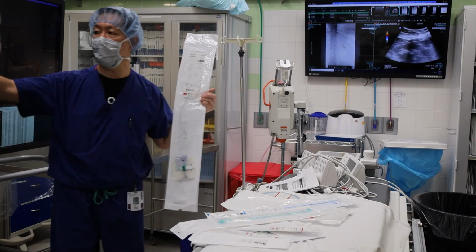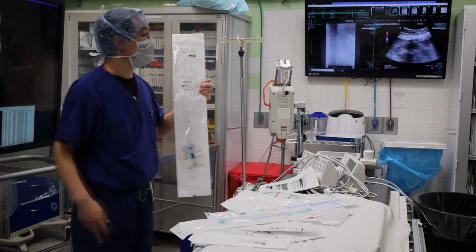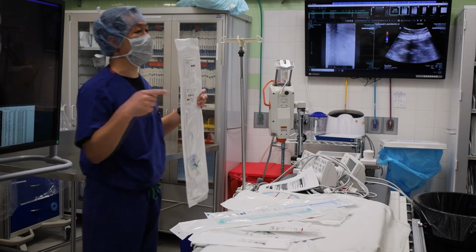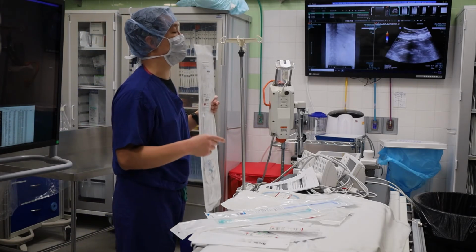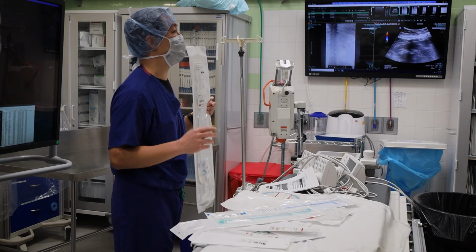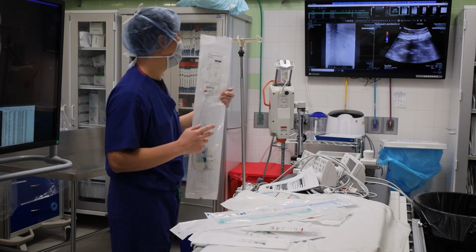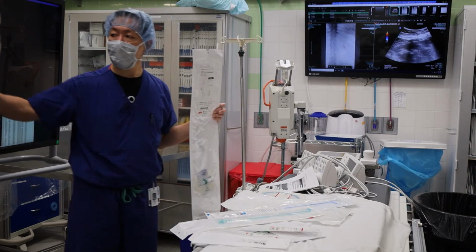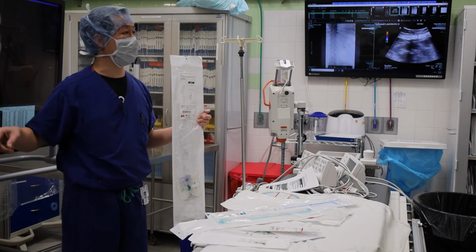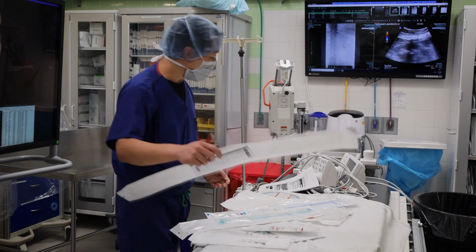And the lengths we actually measure from the distance of the renal pelvis down to the bladder. If we put in the wrong length, you have a piece of plastic that's pushing against their bladder all the time, and patients absolutely hate it. They will tell you, oh, I feel like I've got to pee all the time, and it sucks. Can you imagine, all night you feel like you're peeing? Irritated. Right. And so we oftentimes have to measure the length, and then we have to form it correctly. And so that's it.